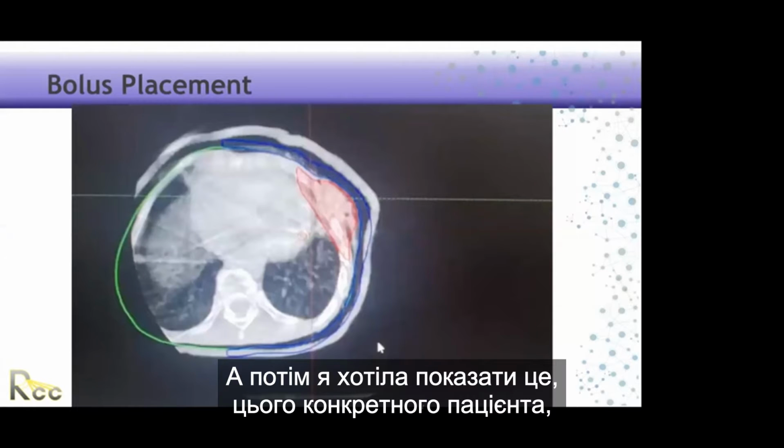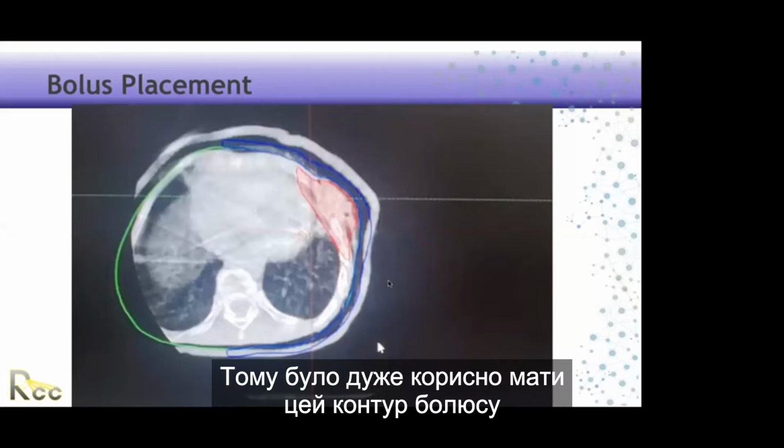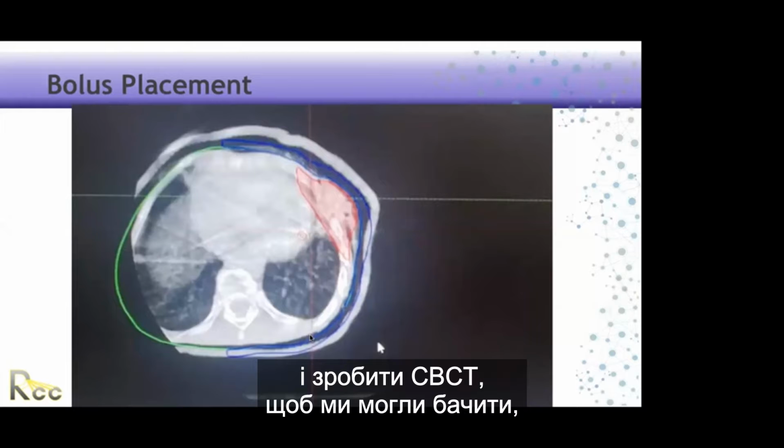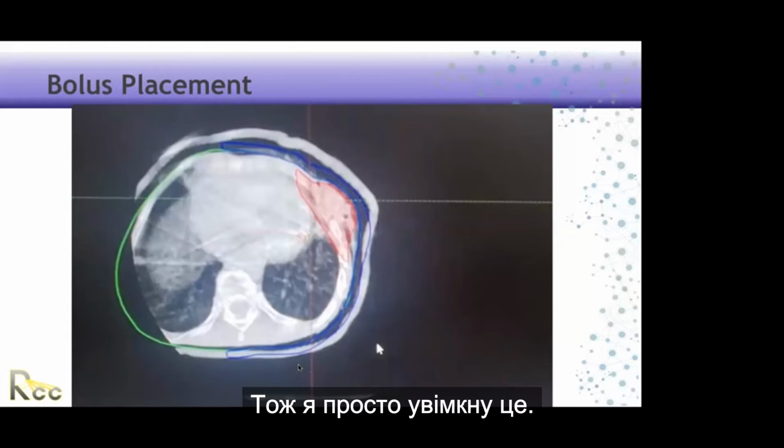And then I wanted to show this. For this particular patient, they added a bolus after we did the CT scan. And so it was really helpful to have this bolus contour and do the cone beam so that we can see that it's still flush and in the proper position. So I'm just going to play it.